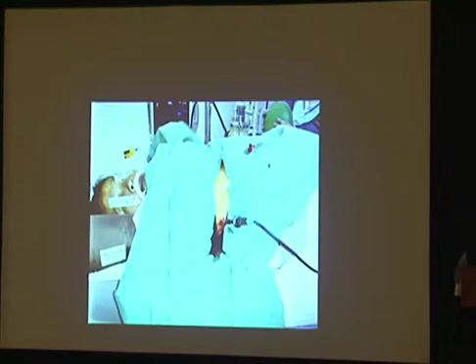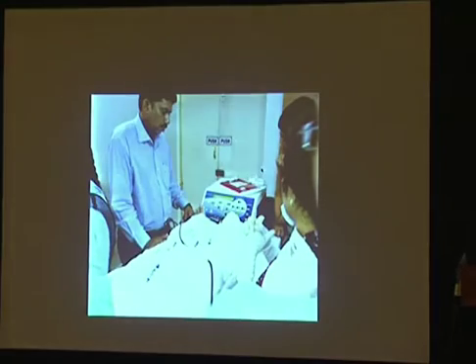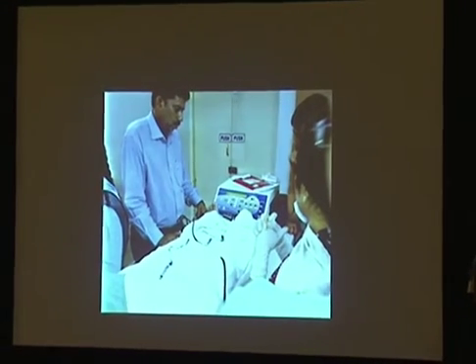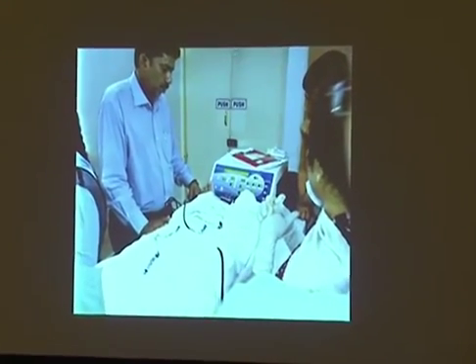This is one such patient where the ablation was being performed. It is done under general anesthesia. The needle is placed, there's a right-sided tumor here, a right lobe tumor. The needle is placed by the right subhepatic, intercostal approach here. And this was connected to the machine here. This is the ablator, the radiofrequency ablator machine, which generates the heat.